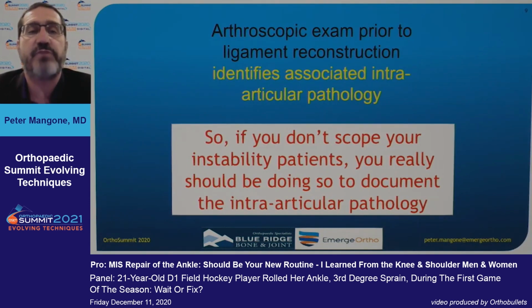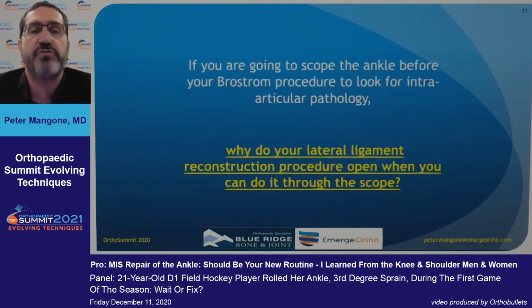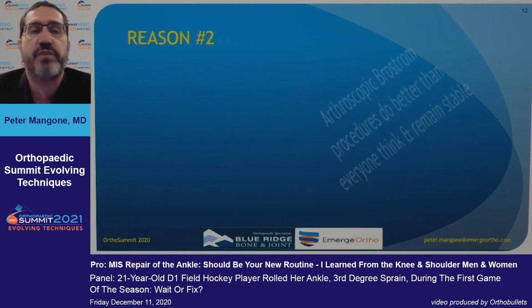And so many of us are doing arthroscopic exams prior to our lateral ligament reconstruction. We saw Dr. Watson take down the leg out of the leg holder. So, if you're not scoping your instability patients, you probably should be doing so. And if you are scoping them, then why not just do the lateral ligament reconstruction when you're doing the scope? Why sit down and take it out of distraction or take it out of the leg holder when you can do it right then and there?